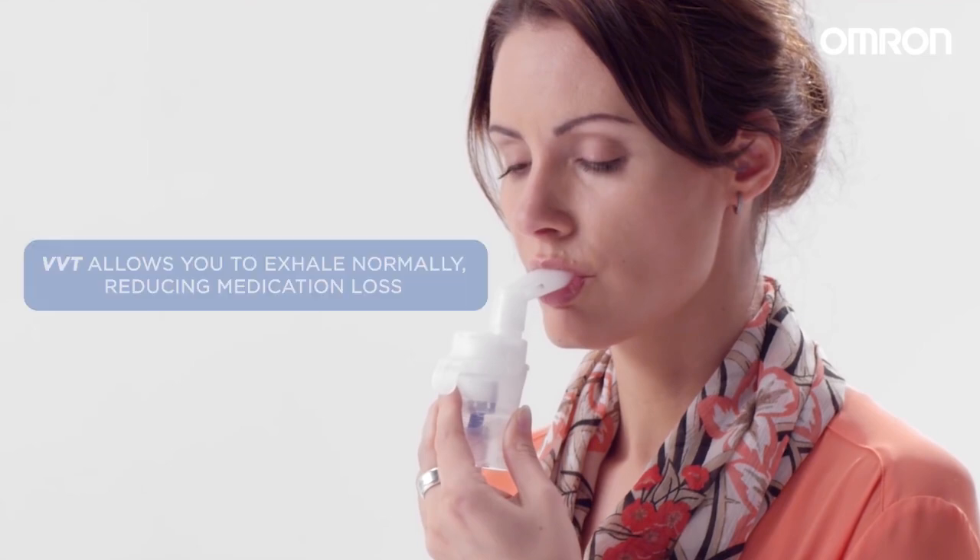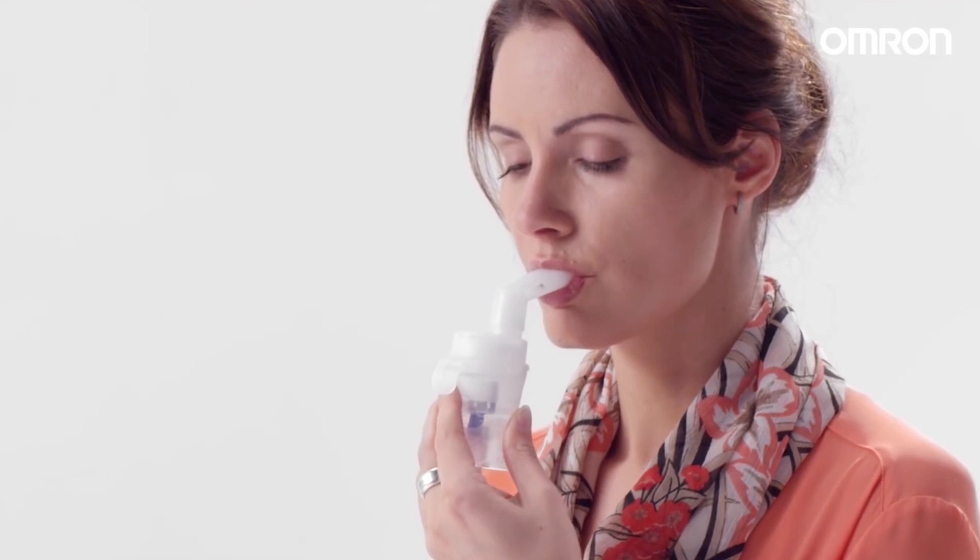Unlike other nebulizers that can waste medicine when exhaling, Omron's VVT technology allows you to exhale normally through the mouthpiece to reduce medication loss.